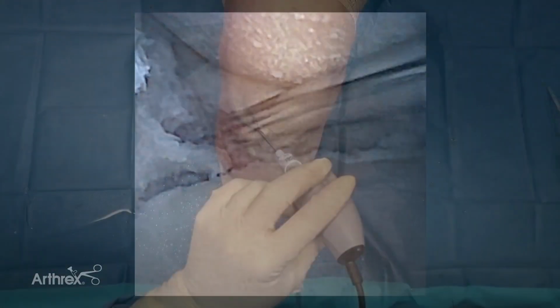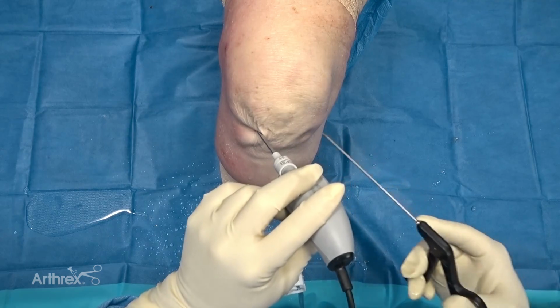One thing I'd like to point out is how fast this partial lateral meniscectomy has been compared to my experience with other shavers of its like and size. And this is dramatically reducing the amount of time to do a standard partial lateral meniscectomy with a shaver. You can see right there in the back posterior lateral aspect of the knee, there's a small little area of meniscus. We're going to come in from medially, and we're going to bite that area out with this small nanobiter.